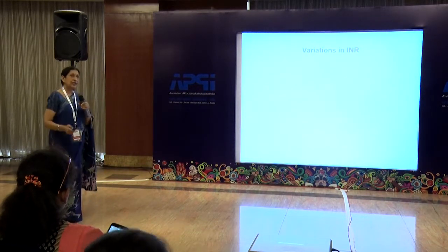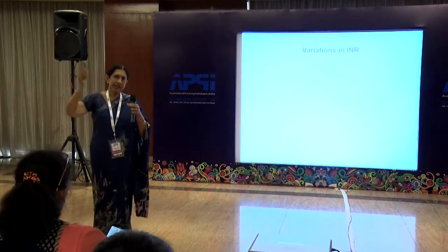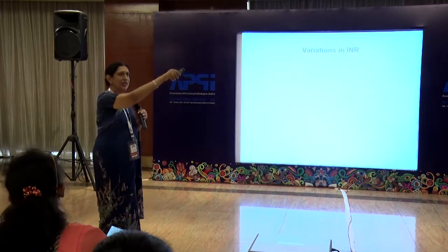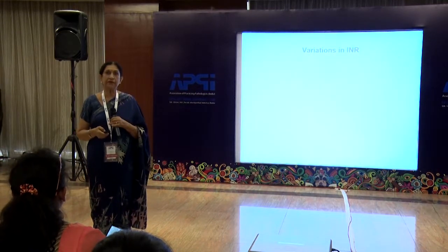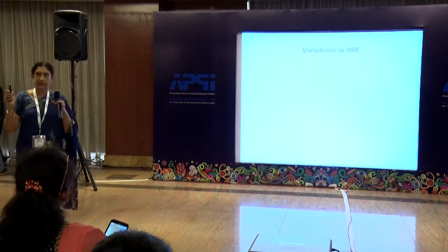Why does variation in INR occur? I do it in my lab. The International Society says you should have the INR so that whether I do it here or there or in Chandigarh, everybody should have the same INR. It has never happened. It never happens because thromboplastins are different.